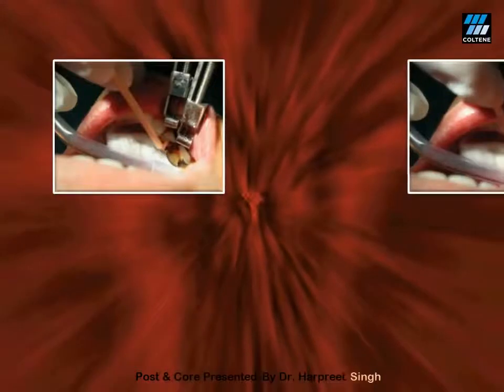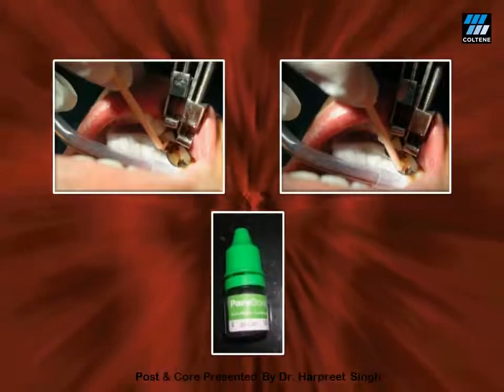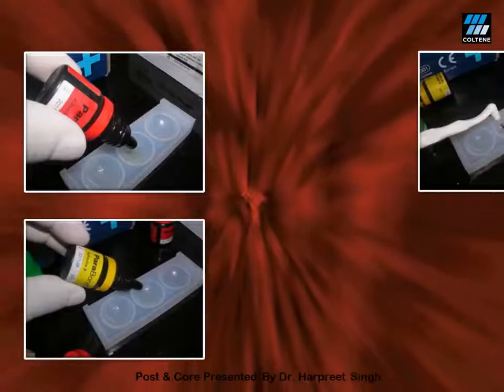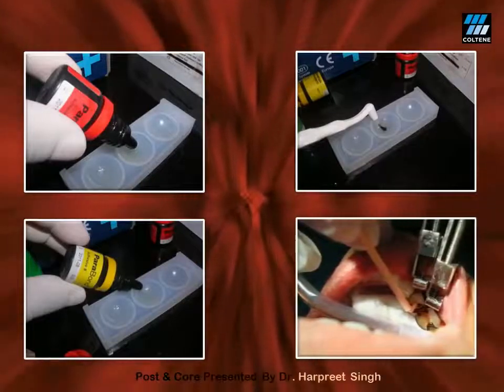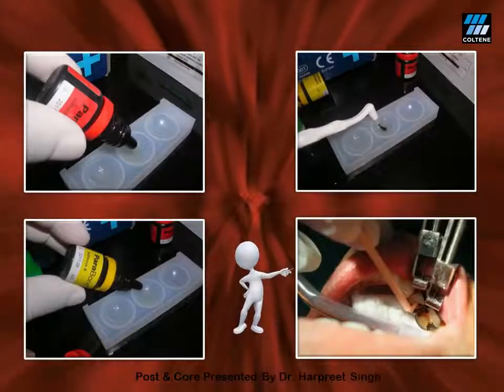Now is the time to condition the dentine. After placing an appropriate matrix, use a non-rinsed conditioner in the post space preparation as well as in the pulp chamber. In this case, I have used NRC from the ParaCore kit. Apply this for 30 seconds on the dentine, then absorb the extra from the post space using paper points. Next, apply a chemically cured bonding agent — one drop of base and one drop of catalyst of ParaBond is mixed in a mixing well and applied in the post space as well as in the pulp chamber for 30 seconds. After that, the extra is absorbed from the post space using paper points and the extra in the pulp chamber is air-dried gently.